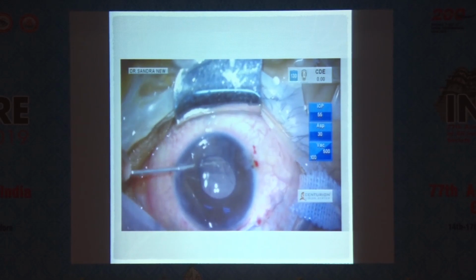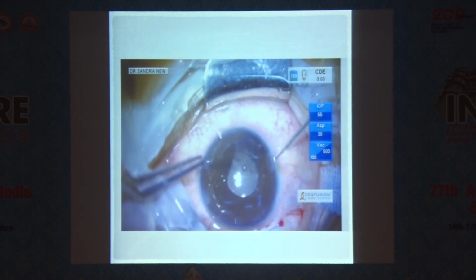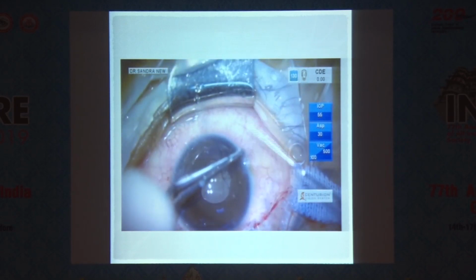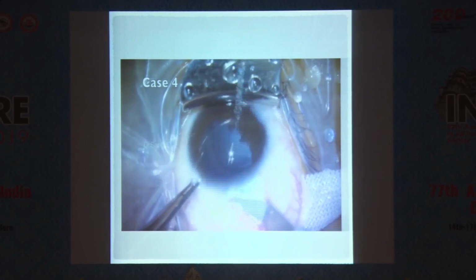Following the placement of the IOL in the bag, the iris tissue defect is repaired with the help of a Prolene suture, because since it is in the 7 to 9 o'clock position, there can be a lot of glare if we leave it just like that. So with the single pass four-throw pupilloplasty is done, and the pupil is reconstructed.